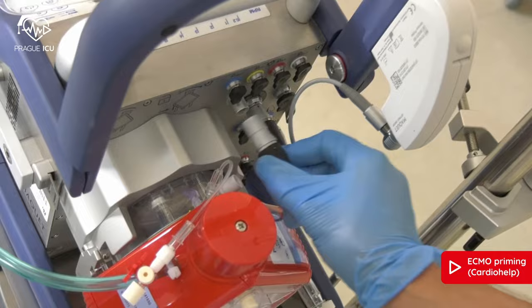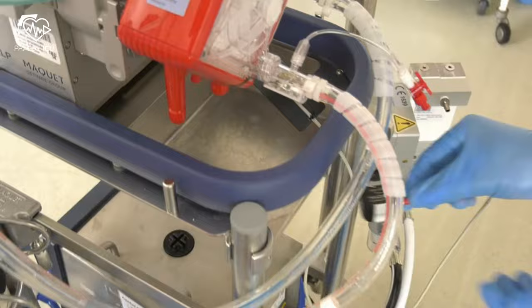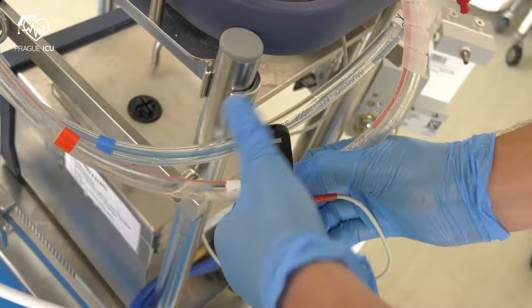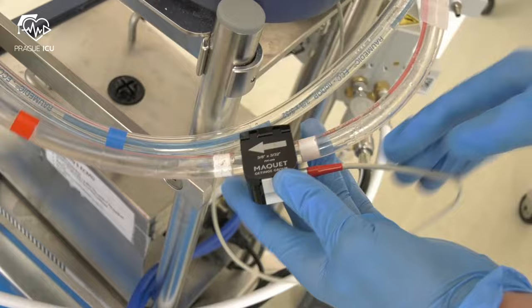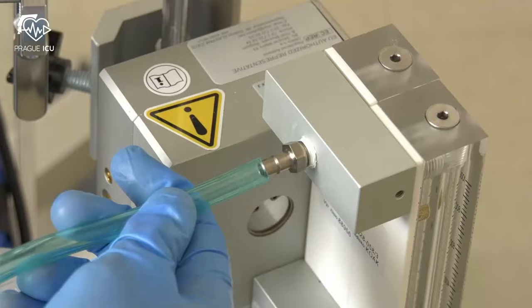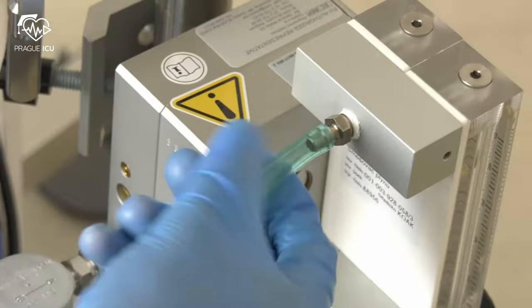Leave the de-airing membrane — the one with the yellow cap — open. Connect the cable for the integrated sensors to the connector of the module. Attach the flow bubble sensor to the red line between the white marks; the arrow on the sensor points in the direction of flow. Connect the end of the gas supply line to the gas filter on the HLS module and the other end to the gas blender or gas supply unit.